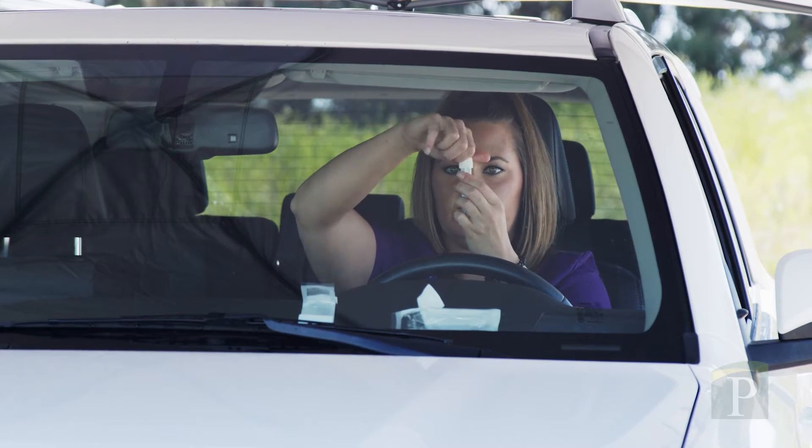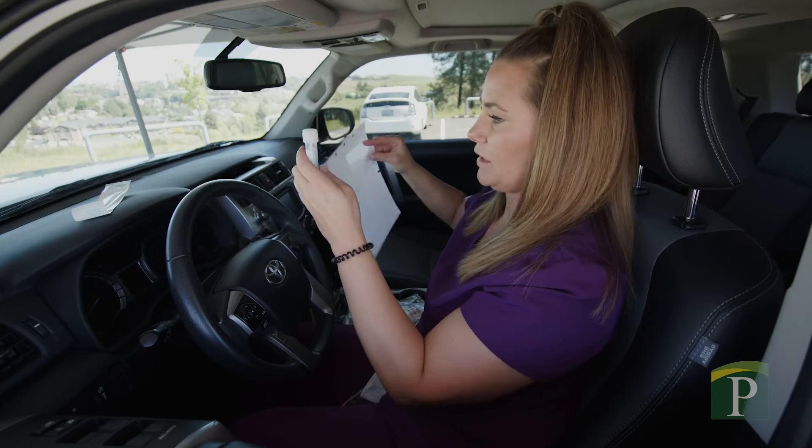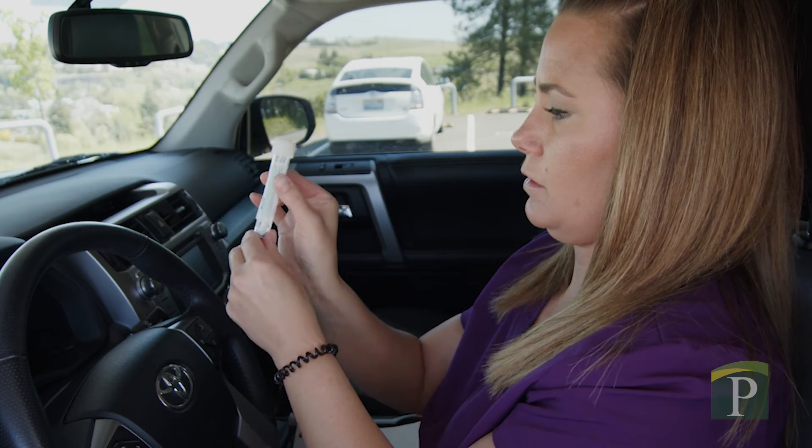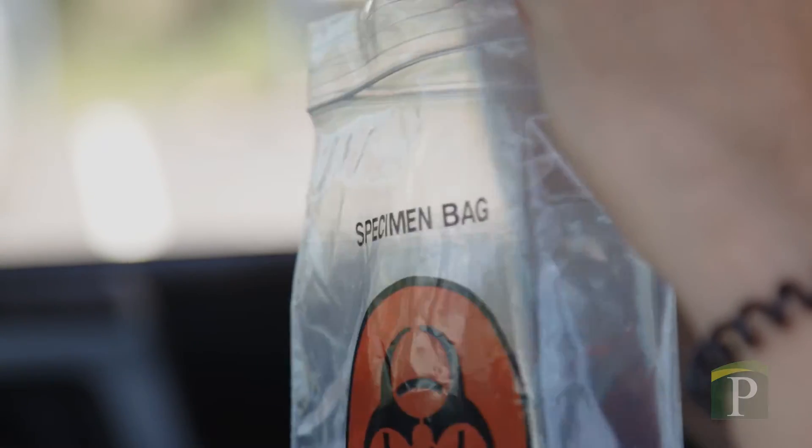Replace the cap on the tube tightly and you are done. Finally, label your tube with a sticker showing your name and the date and time, and place the completed sample inside the specimen bag.